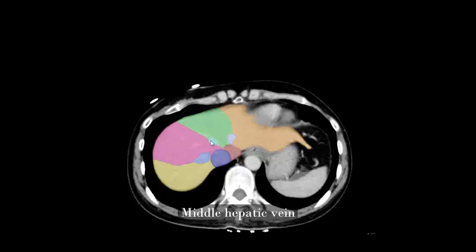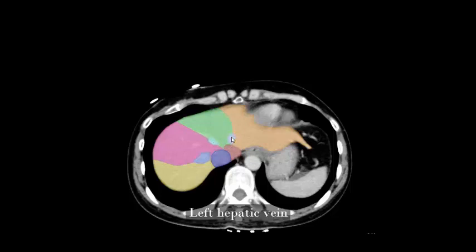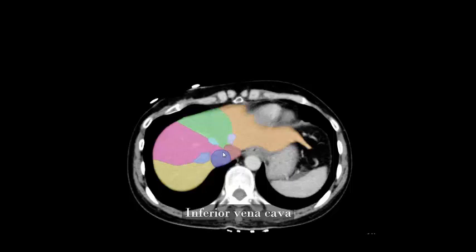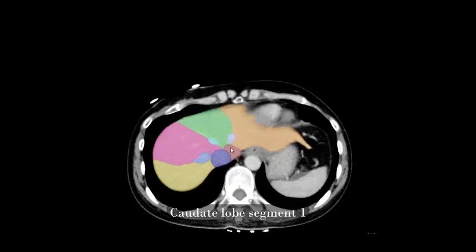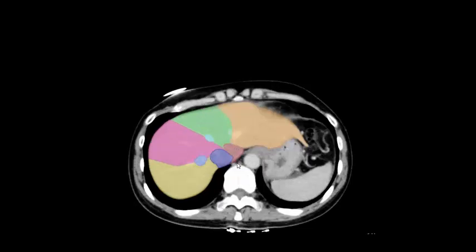Middle hepatic vein, left hepatic vein, inferior vena cava, caudate lobe segment 1, liver segment 7.